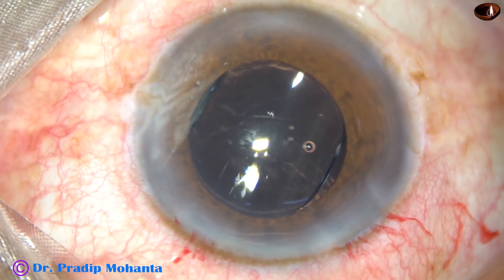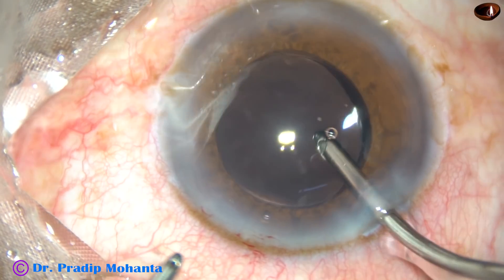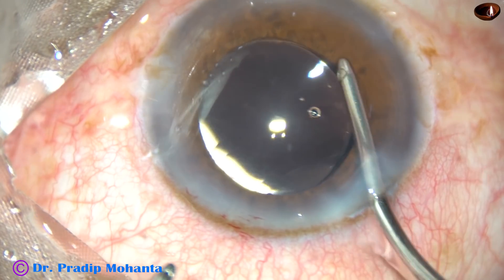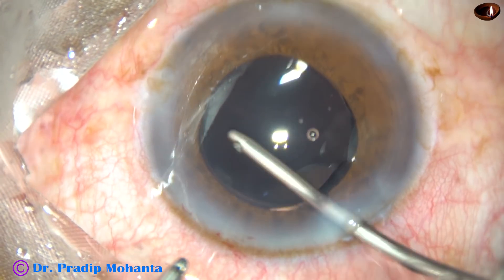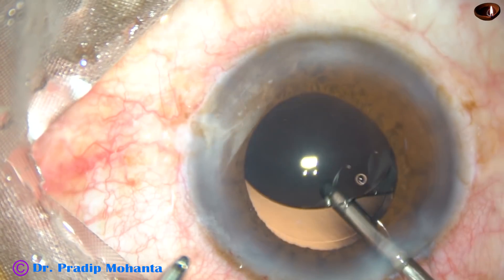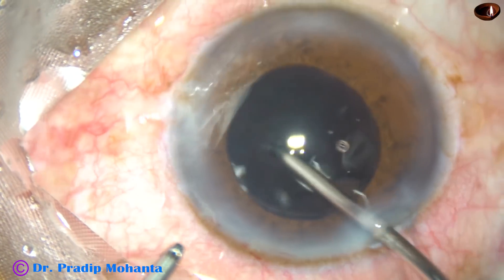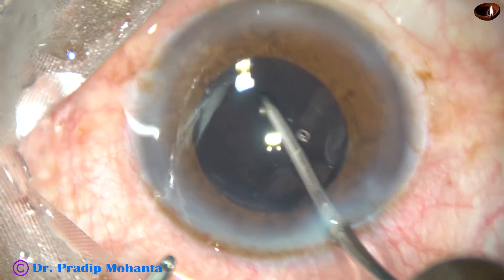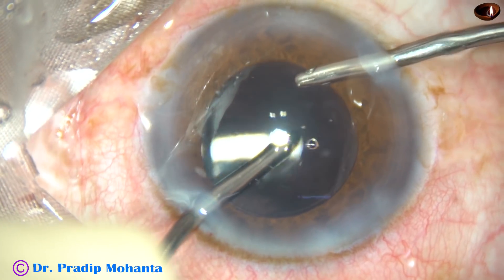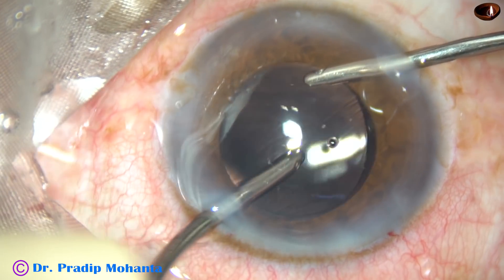Now the viscoelastic substance — 2% HPMC that has been used — has to be cleaned out very thoroughly so that we can avoid post-op rise of visco-related intraocular pressure. This is irrigation by the irrigating probe of bimanual I/A — go behind the IOL and irrigate the capsular bag. Thorough irrigation of the anterior chamber, the anterior chamber angle, and the capsular bag removes most of the viscoelastic substance. Then irrigation and aspiration are used together to remove the rest of the viscoelastic substance.